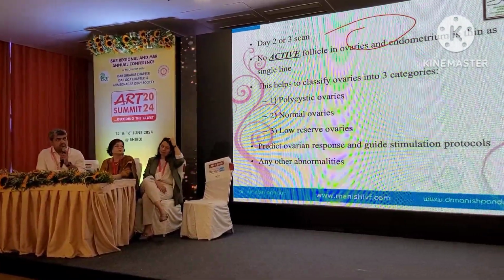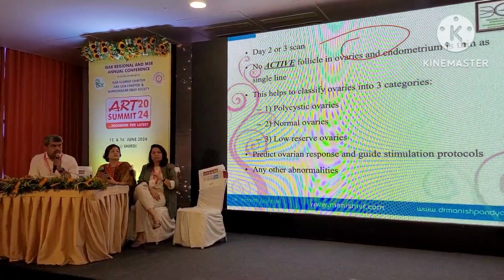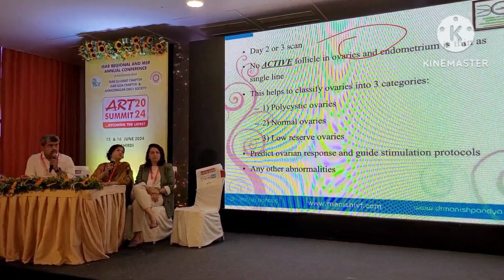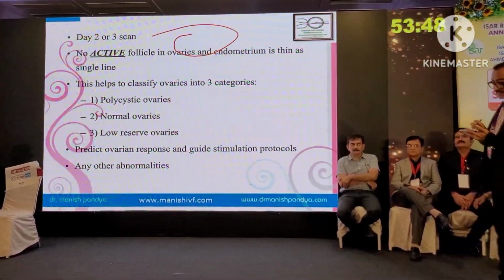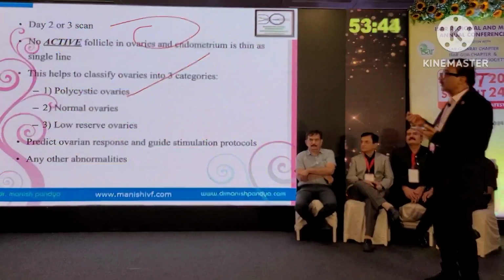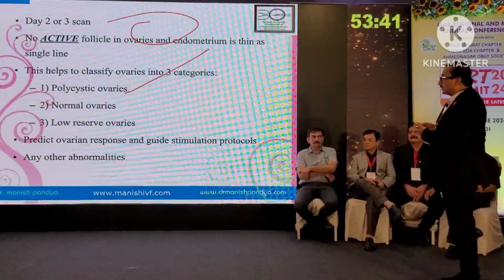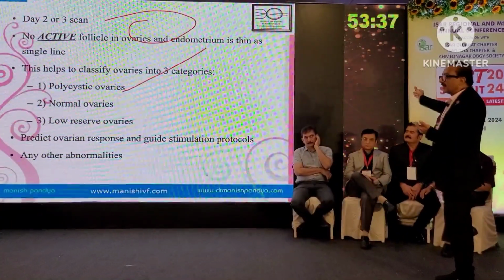Would you like to see the endometrium? On day 2 there will not be much seen in the endometrium. But if it is hyperplastic then? Yes. So on day 2 baseline scan you have to see the endometrium, you have to see the ovaries, type of ovaries: normal ovary, PCO ovary, low reserve ovary. And you also think about on which day this patient could go for ovulation induction or IUI or IVF.